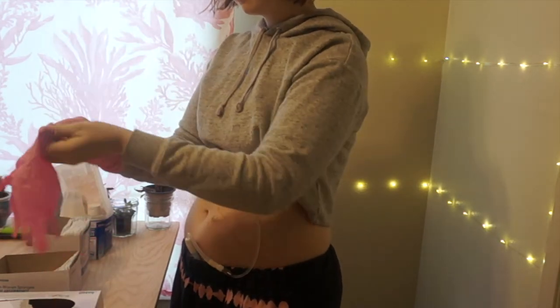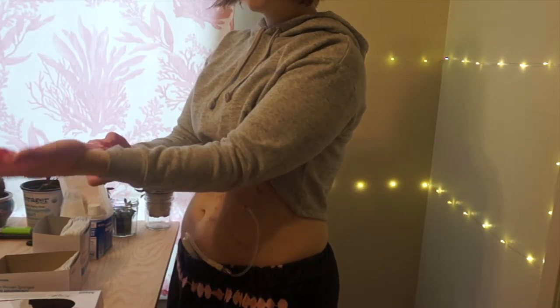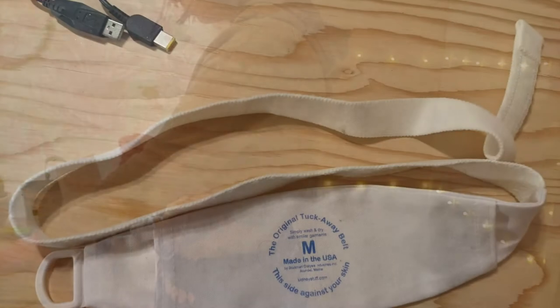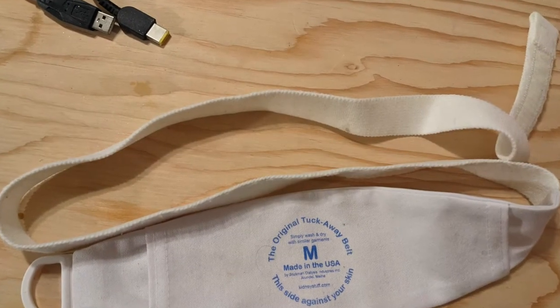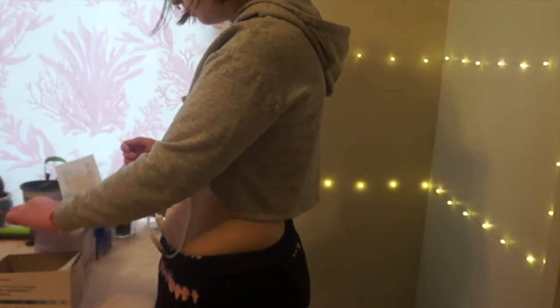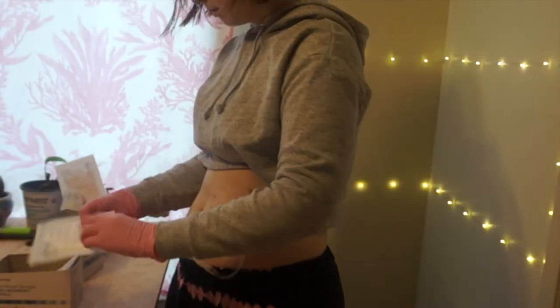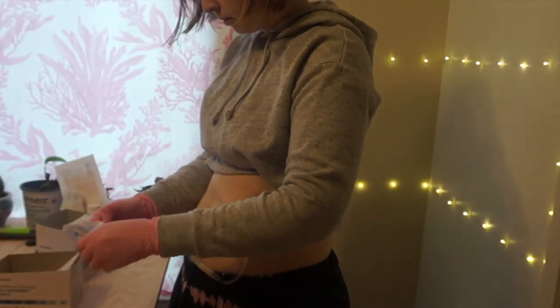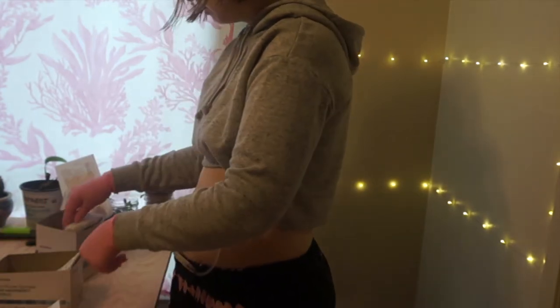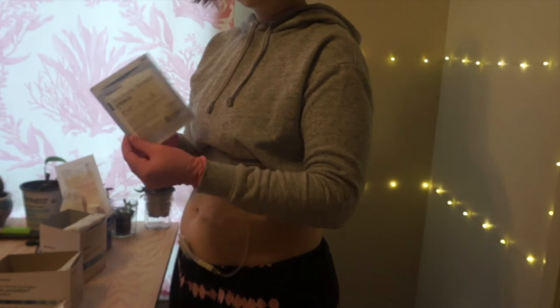After my surgery I tried a few different ways of securing my catheter that the dialysis nurses typically recommended — using one of these belts pictured, as well as a running belt that I would try to slip the length of the catheter into. They felt too bulky and I didn't really feel comfortable while I was at work, so I decided that the best way would be to secure it similarly to how I came out of surgery.